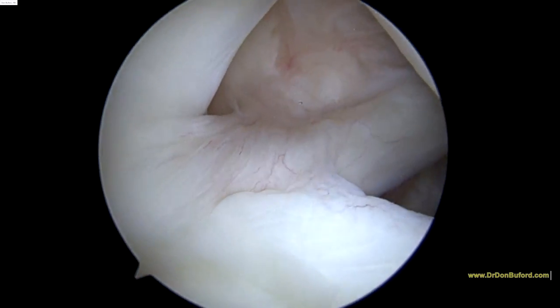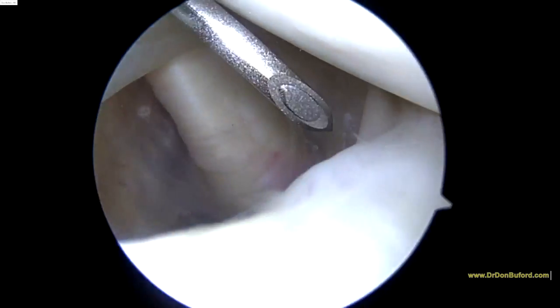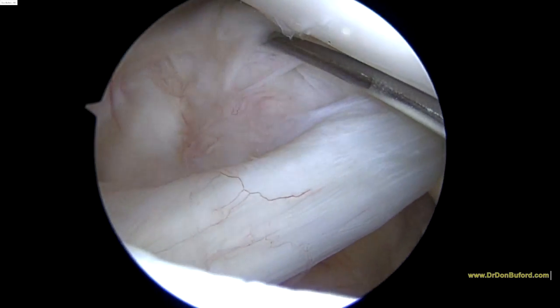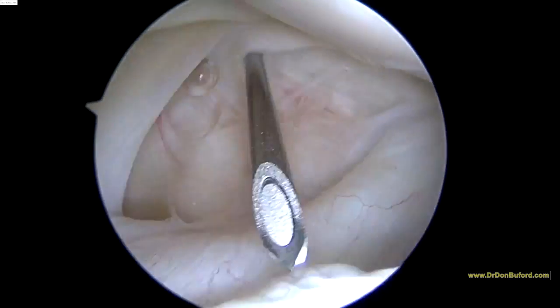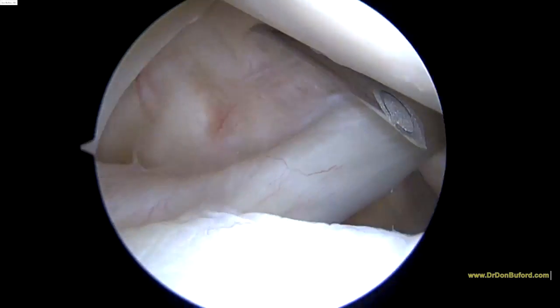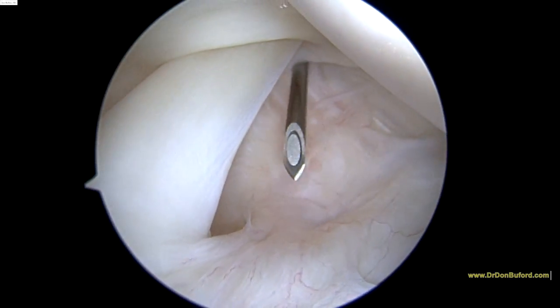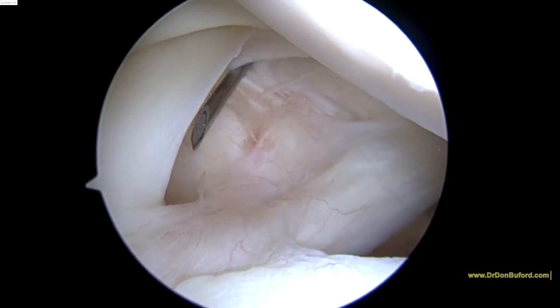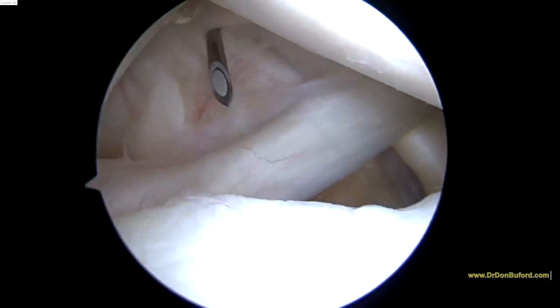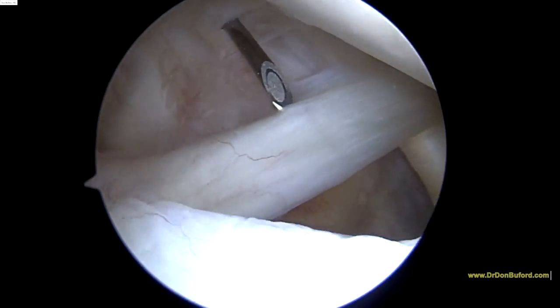And those are the two major ligaments in the front of the shoulder that we can see. As far as the superior glenohumeral ligament, we can't really see that because it would be behind the biceps, and that's not really a structure that we can typically see and target arthroscopically.